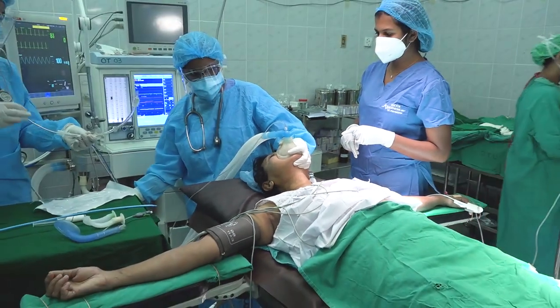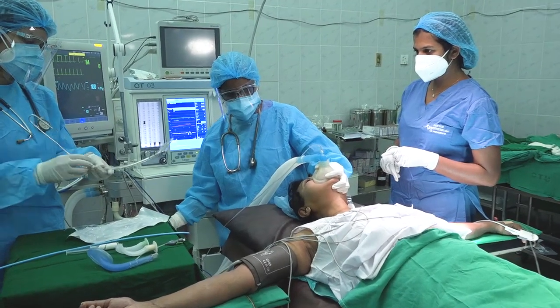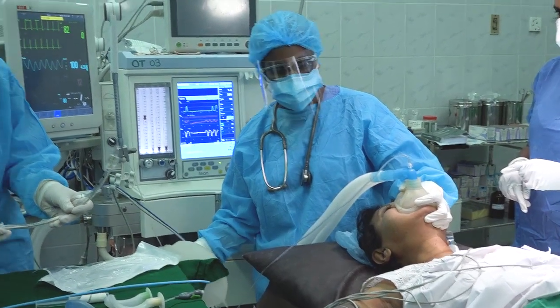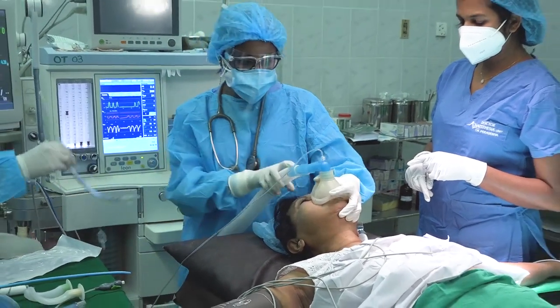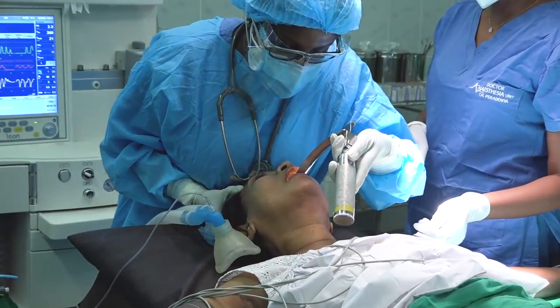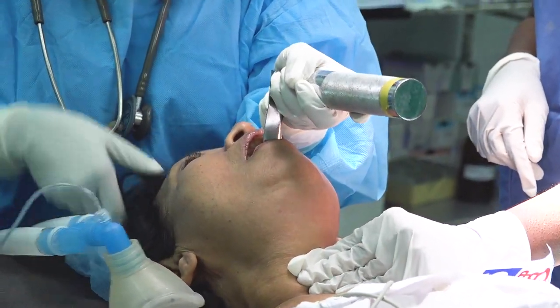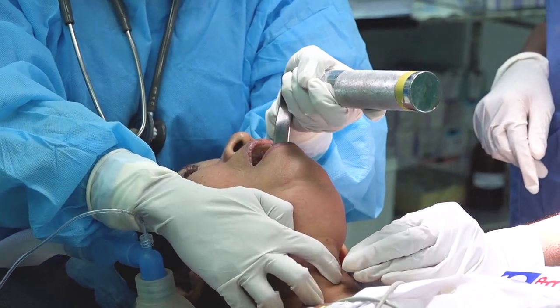Make sure the tip of the endotracheal tube stylet is not jutting out through the distal end of the endotracheal tube. Try to see the laryngeal opening. Lift the laryngoscope upwards towards the roof. Do not lever the blade at this moment. External laryngeal pressure in the form of BURP, backward, upward, rightwards pressure applied on the thyroid cartilage will be very helpful to visualize the glottis.